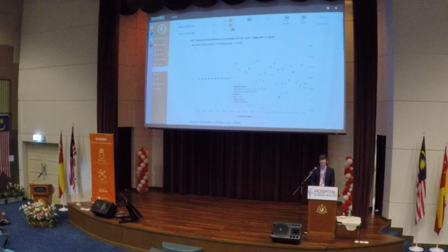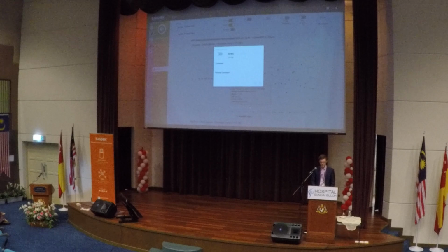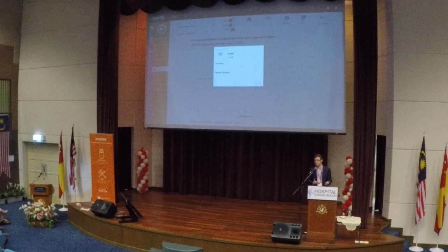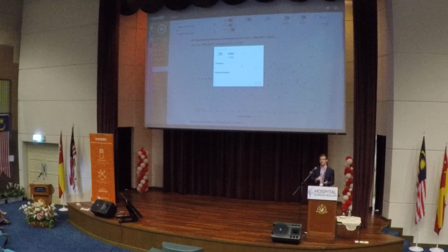So if we left-click on one of our QC results, we can also enter comments. Say, for instance, this result was highlighted in orange as an alert. We might want to say why we think that was. This was an alert potentially because of a calibration issue. That was then fixed, and our results returned to normal. So we can just have full traceability on here.